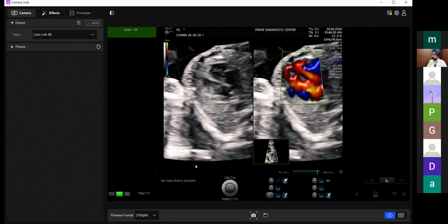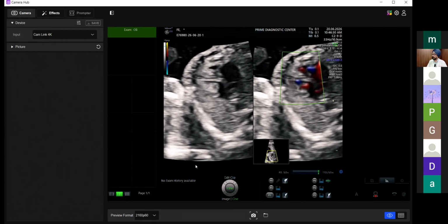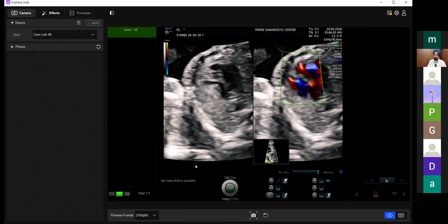Like in 2D, we cannot see any. Yeah, that's why we are hunting. Exactly, and we had just scanned this patient cursorily in my regular clinic on the ground floor, and we didn't pick up this VSD, and now we've hunted for it, and it is there. So if you are going to hunt for it, you are expected to see too many VSDs actually.